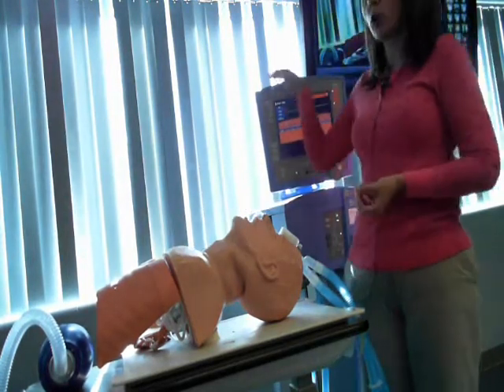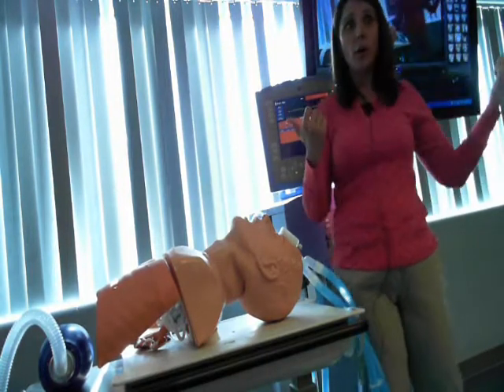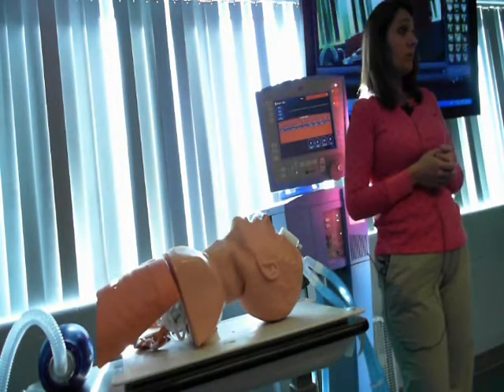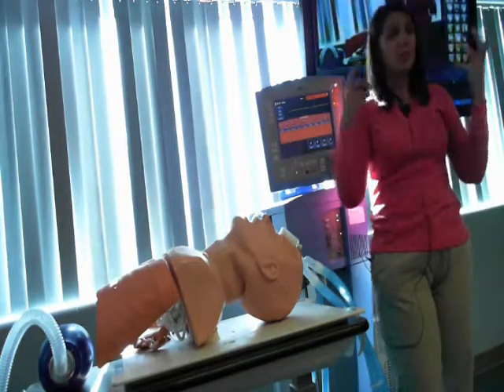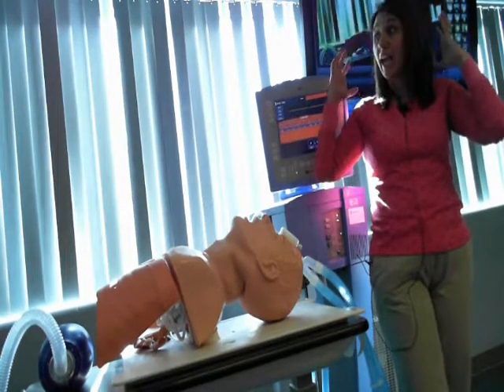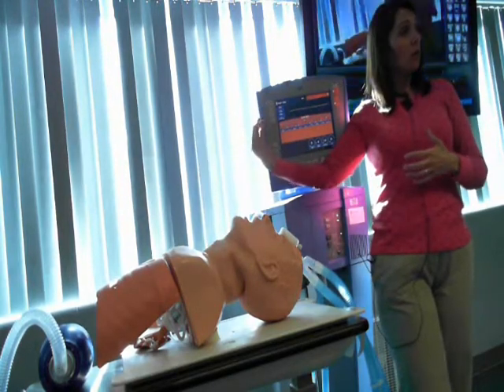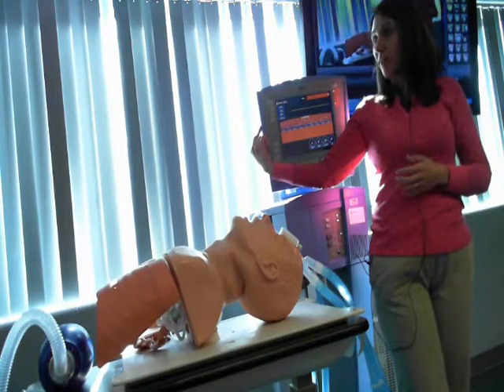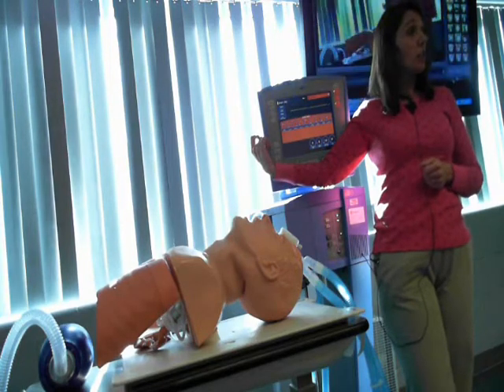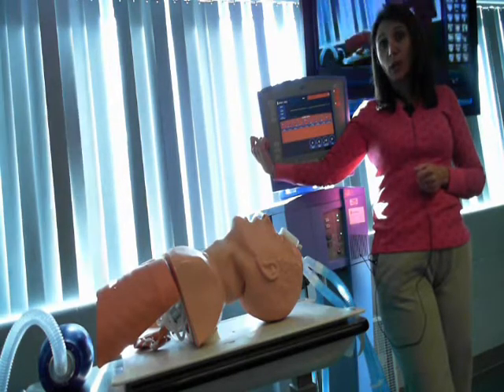So when this vent is alarming, oftentimes when you are new on critical care, this vent's going to be alarming. The cardiac monitor is going to be alarming. Your IV pump might be alarming. That's really overwhelming. And I have seen it time and again, not just nurses, I've seen it with therapists. You go in there and you get overwhelmed, and the thing that has the loudest alarm gets your attention. With a mechanical ventilator, this thing costs about $45,000 to $55,000. It is a wonderful piece of technology. But once it's alarmed, it needs you, it needs the therapist to figure out what's going on.